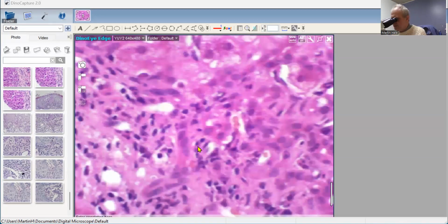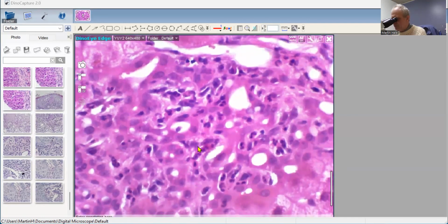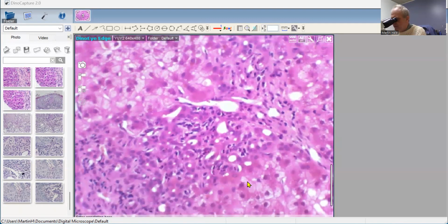When we move to this part of the biopsy, though, what we see now is a slightly different picture. We see bile ductular proliferation, and we've got neutrophils. So we've got ductular proliferation plus neutrophils, and then we go through that same diagnostic algorithm, if you like, that I alluded to in the first biopsy. Could this be ethanol?